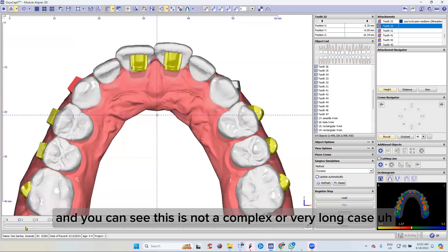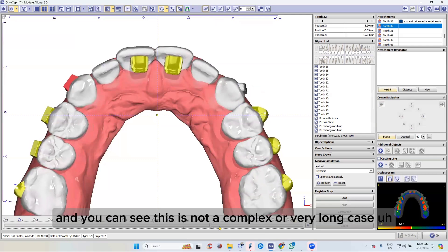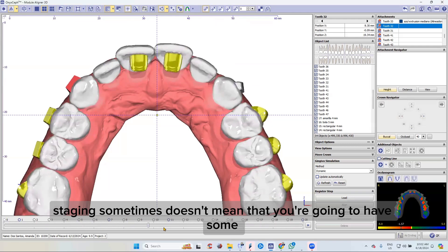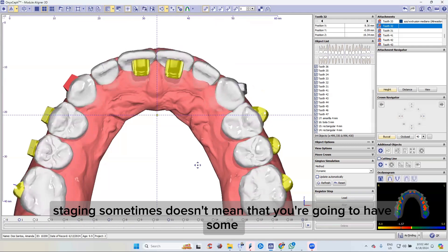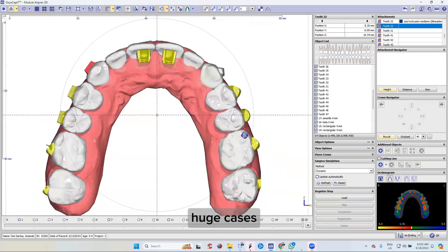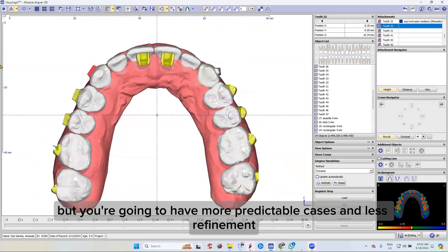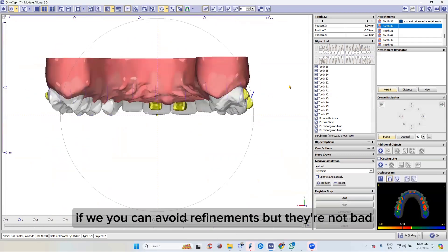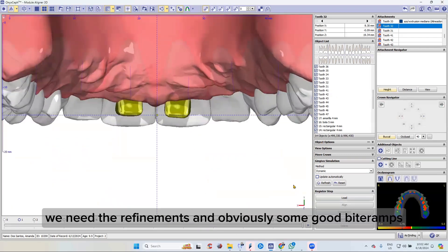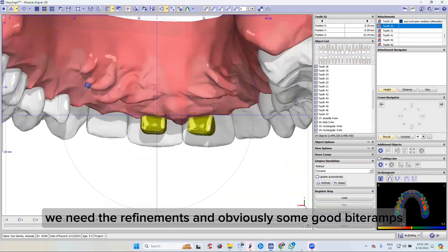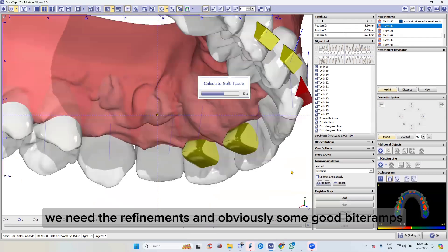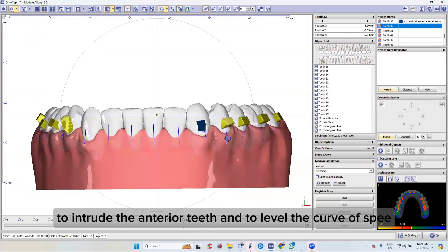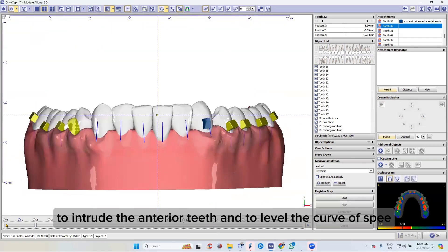You can see this is not a complex or very long case. Staging sometimes doesn't mean you're going to have huge cases, but you're going to have more predictable cases and less refinement. You can avoid refinements, but they're not bad — sometimes we need them, and obviously some good bite ramps to intrude the anterior teeth and to level the curve of Spee.